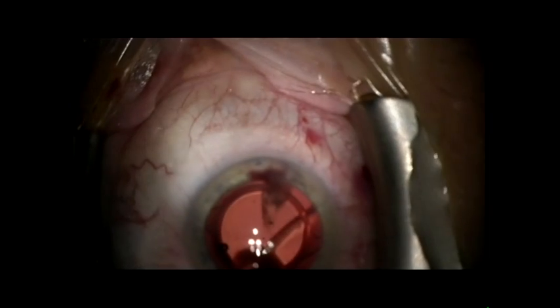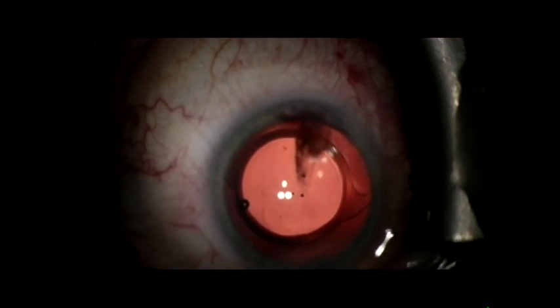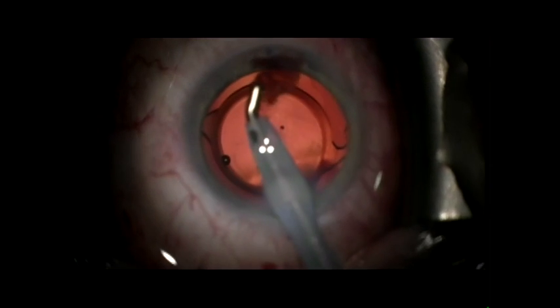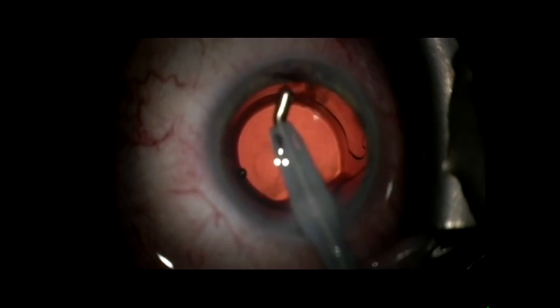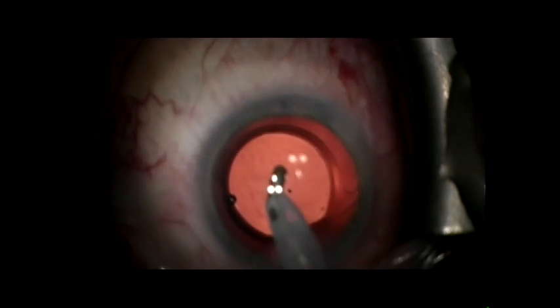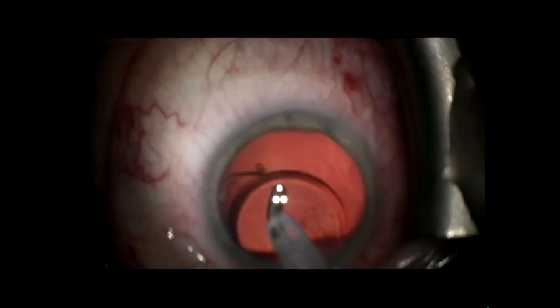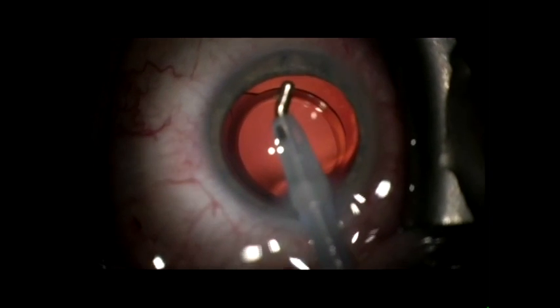The micro catheter is removed. This is done after the eye has been rotated back to the primary position and we are looking straight down at it. The irrigation-aspiration now proceeds in the usual fashion. The small amount of blood that is there from the initial otomy is removed, and once the eye is pressurized, no further bleeding occurs as the blood rushes out of the canal of Schlem.